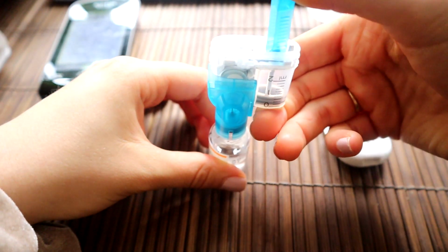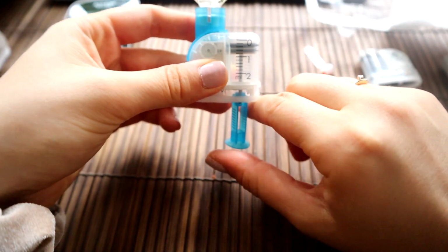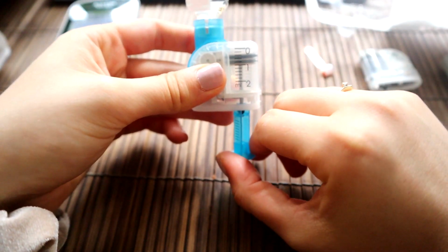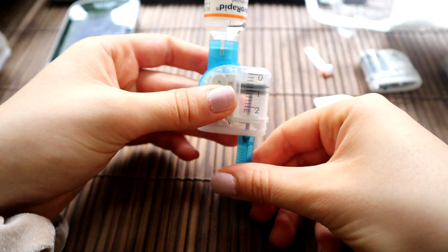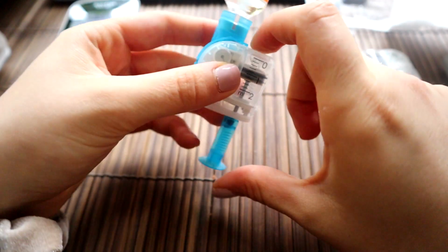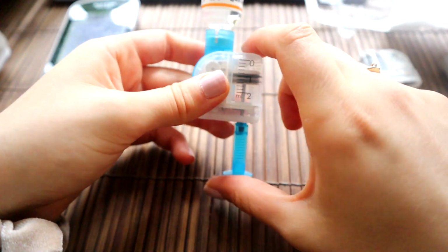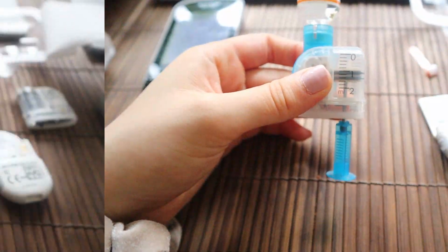Then keeping your thumb on the top, turn it upside down, and then you have to draw the insulin without getting any bubbles. So I'm going to do this off camera because I need to concentrate on it. I don't want to get any bubbles, but essentially just pulling it down and then pushing it up to get rid of bubbles, tilting it to get the bubbles to go up that way, and doing whatever you can to get rid of as many bubbles as possible.